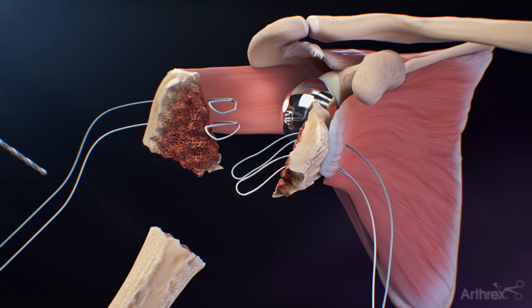Remove the humeral trials and drill two holes in the lateral side of the bicipital groove with the 2.0 mm drill bit. Drill the holes 1 to 2 cm distal to the humeral shaft fracture line.